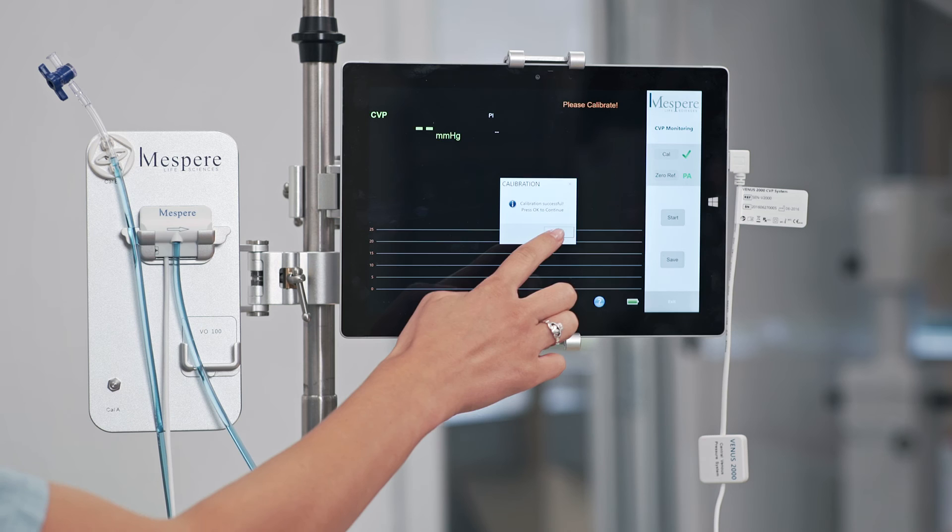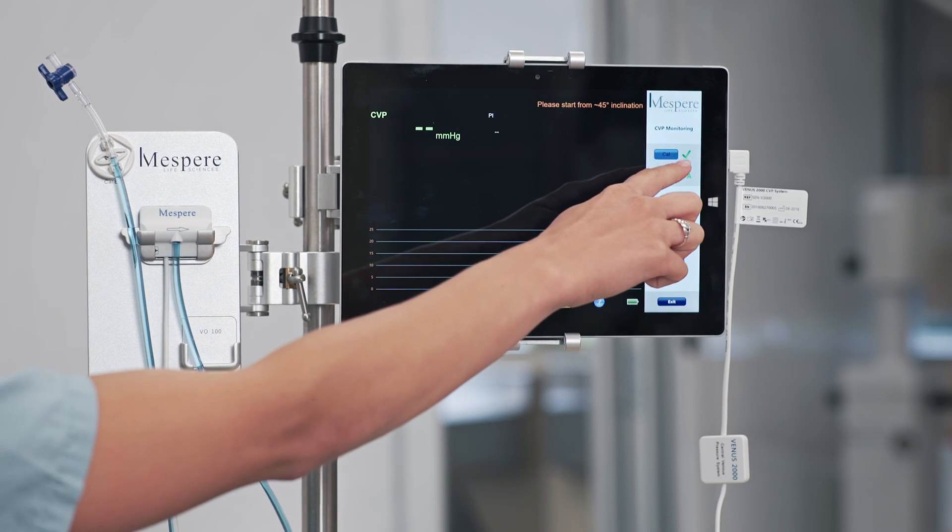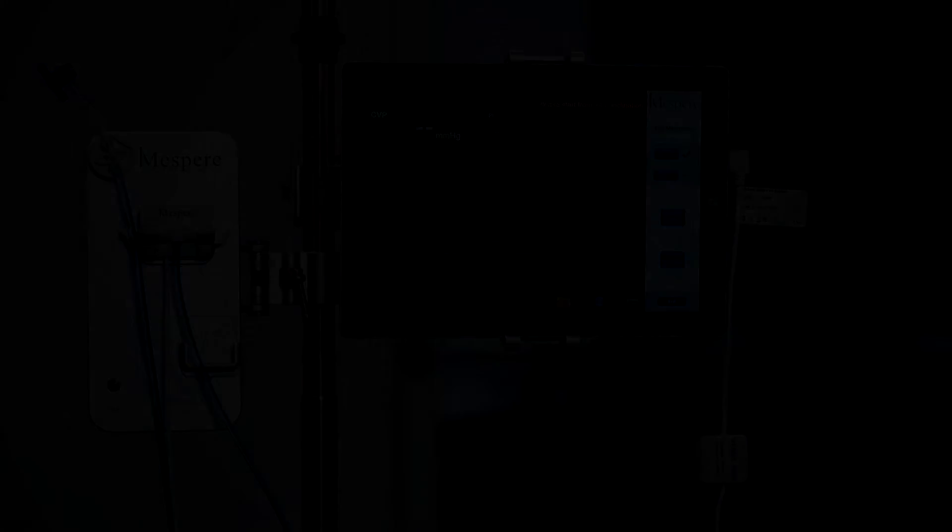Press OK. A green check mark will appear. The sensor is now ready for use.